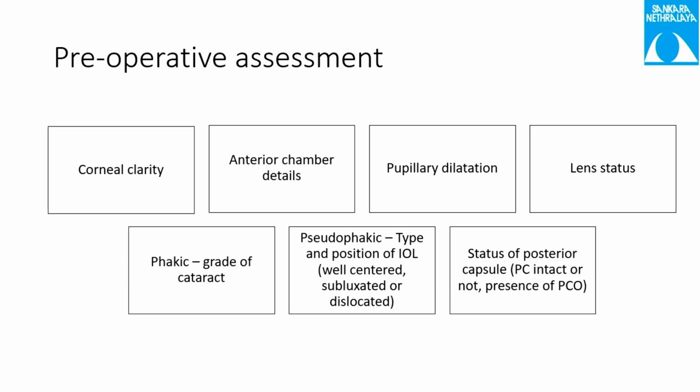So moving on to the preoperative assessment, how to avoid difficulty in endo laser. First thing is one must always examine the patient properly. Look for corneal clarity. Always document if there is any localized corneal decompensation, or if the patient is diabetic or not, because most of these patients tend to develop corneal edema more easily, and we cannot always debride the corneal epithelium, especially if the patient has high sugars, as wound healing will become a great problem.